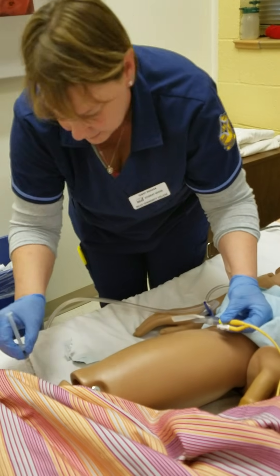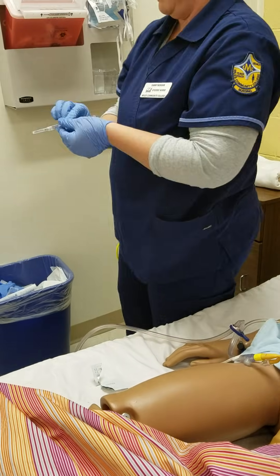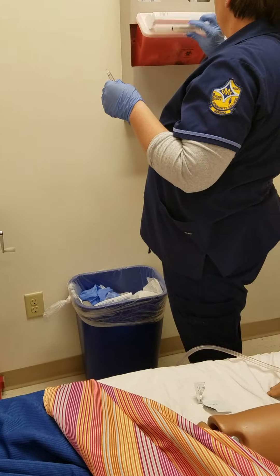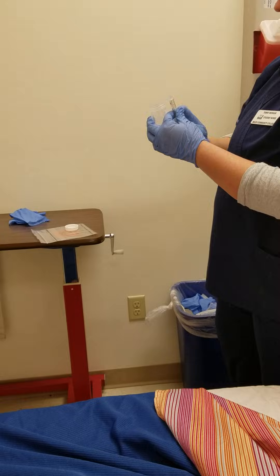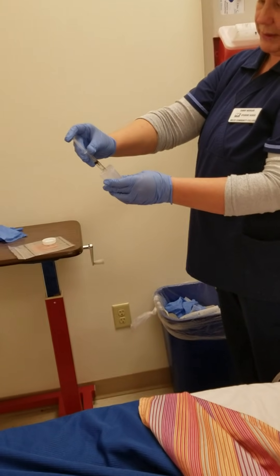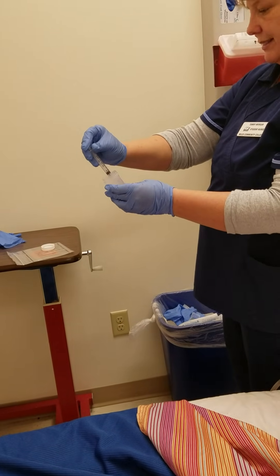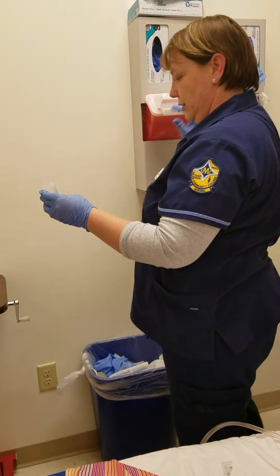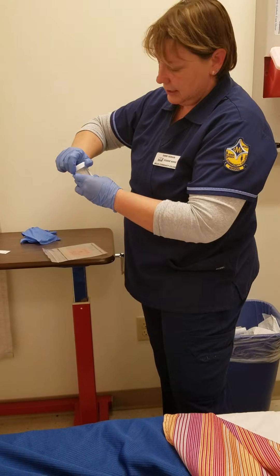I'm going to put the cap back on the syringe, and once I have the cap on I'm going to unscrew the needle and put it in the sharps container. I'm going to get my specimen cup and place the urine into it, holding it away from me and not touching the sides so I don't compromise the sample. When I'm finished with the syringe, I'm going to put it into the sharps container. Then I'll securely cover the specimen cup.